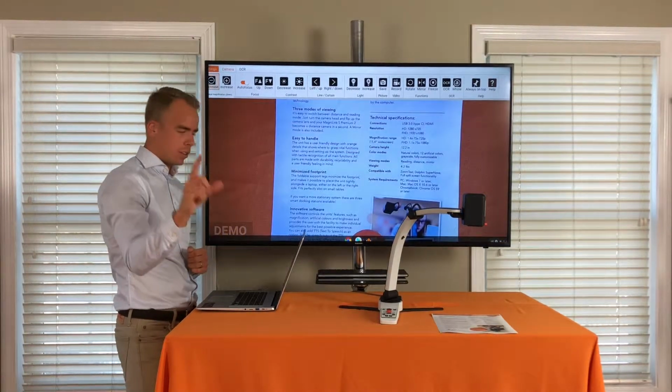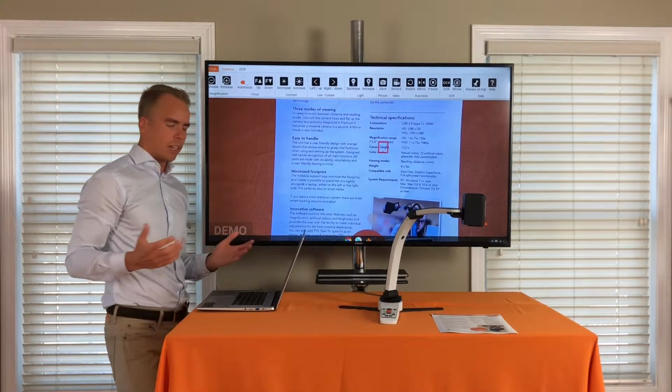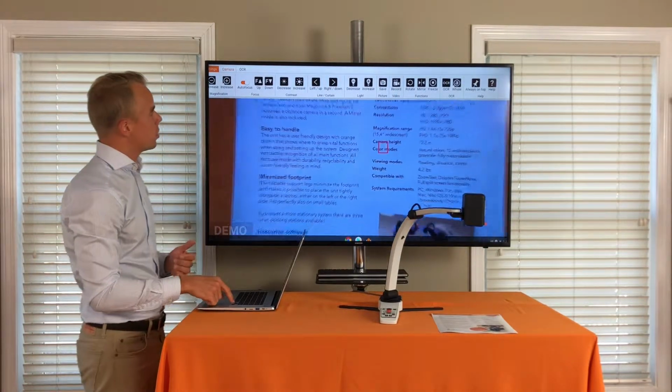I can also do the pinching to zoom in and out. Or like I said, use my short commands on the keyboard. In this case, it's arrow up and arrow down to make it larger and smaller.